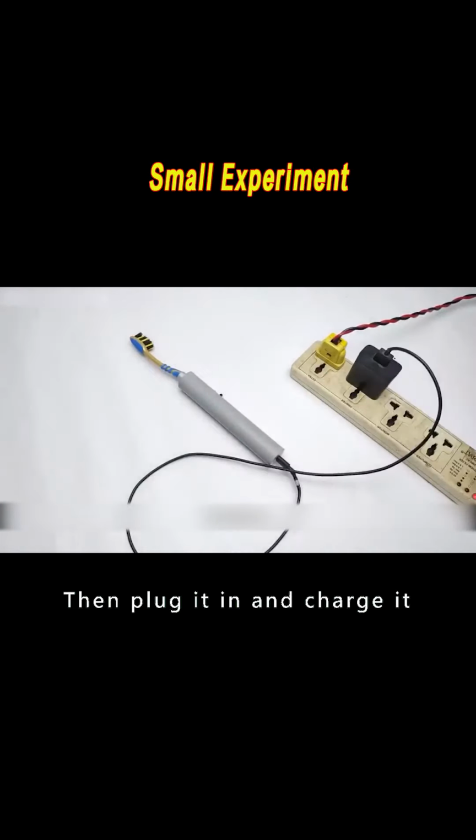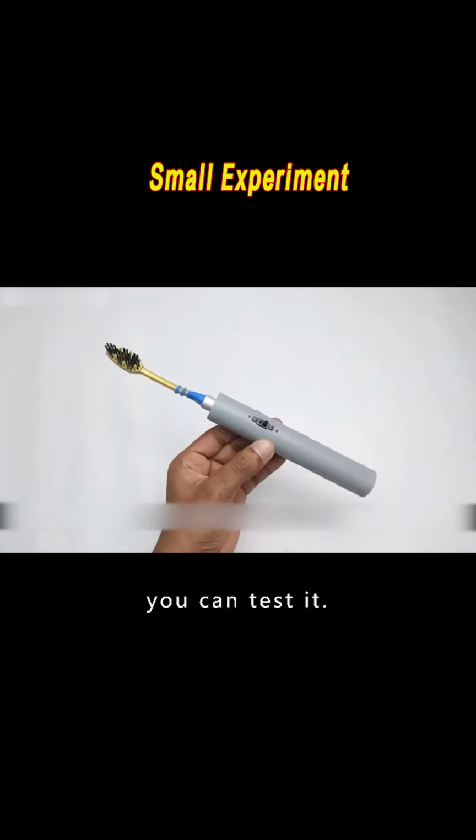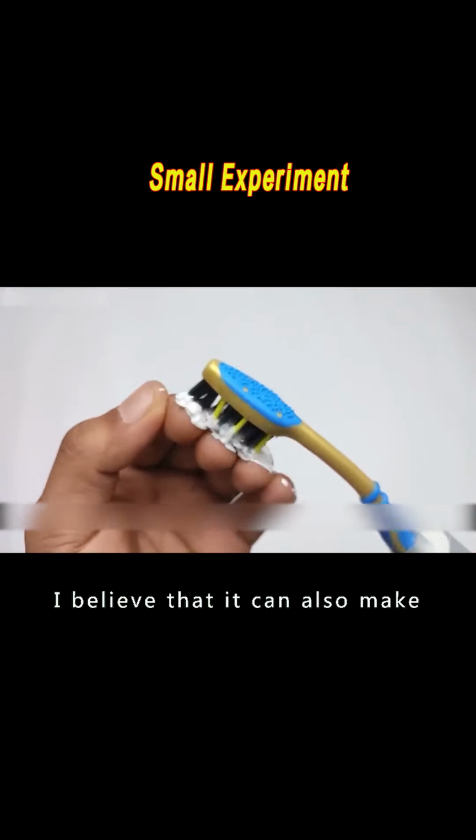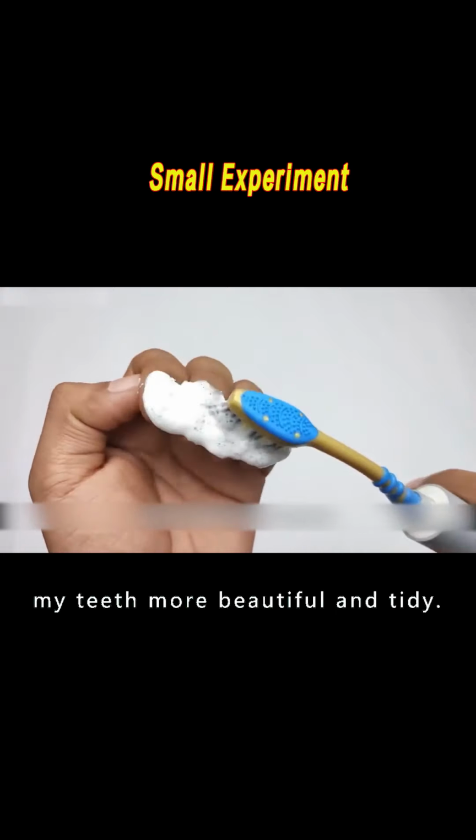Then plug it in and charge it, and when you're done, you can test it. When I turn on the switch, I can see that the bristles are constantly shaking. I believe that it can also make my teeth more beautiful and tidy.